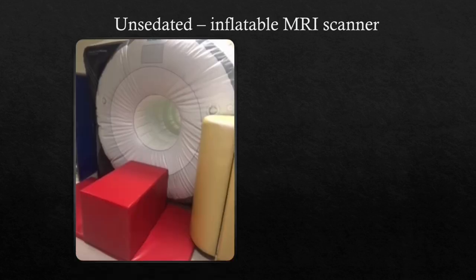We also have an inflatable scanner. This is a copy of our 3T Prisma scanner, and we have it set up in the department, and it deflates and inflates at the switch of a button. It is quite noisy, but that also helps with preparation because the scanners are quite noisy. So even though it's not the exact same noise, you can prepare the patient to be aware that it's going to be quite loud. And it also brings in the element of play.